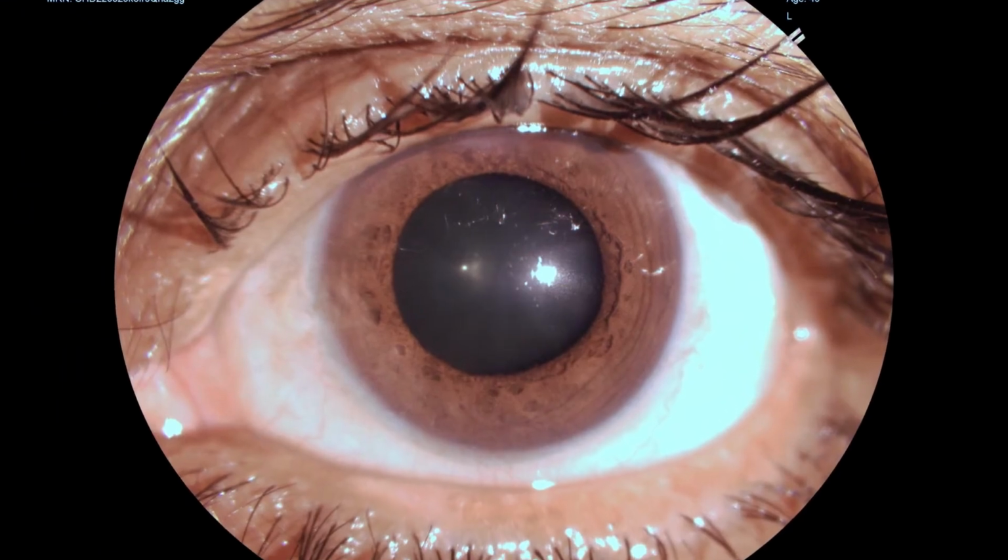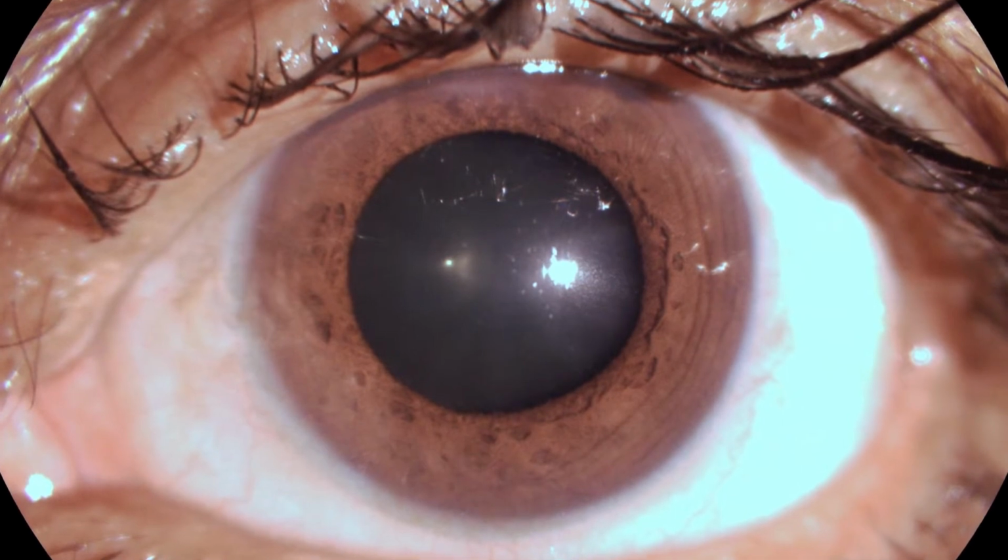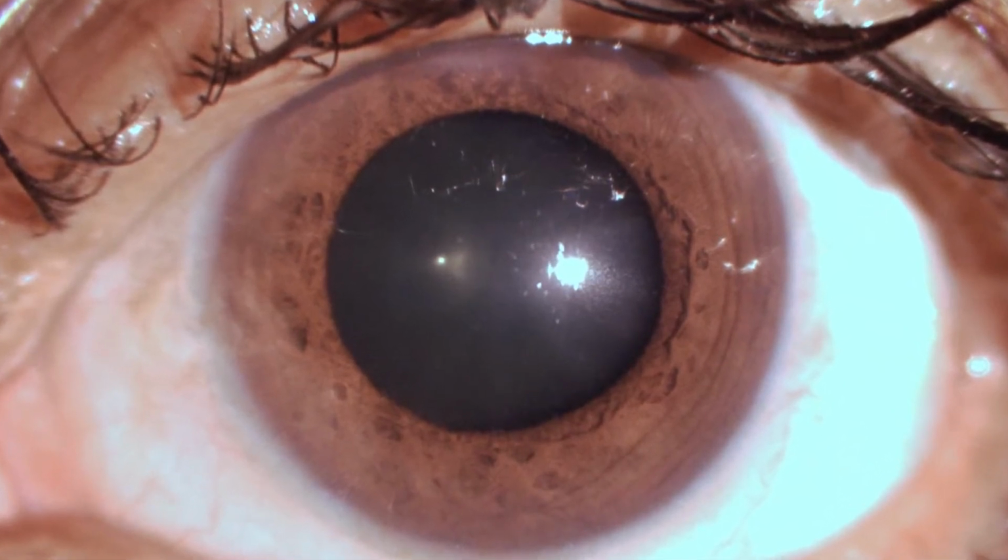This is the patient's picture the next day when the anterior chamber was absolutely clean, there was no rebleed, and the patient's vision improved to 6 by 9 unaided.